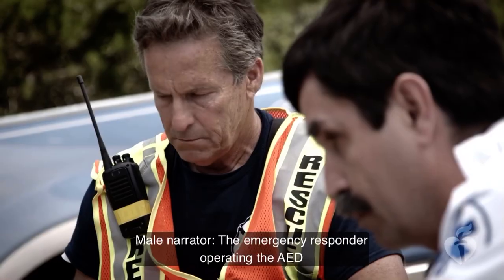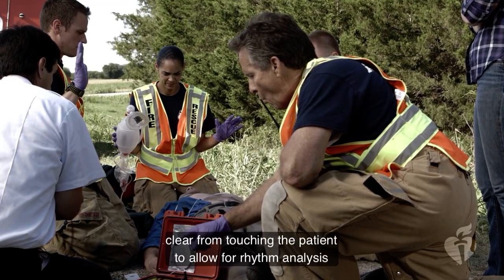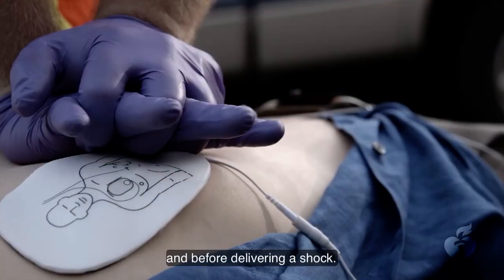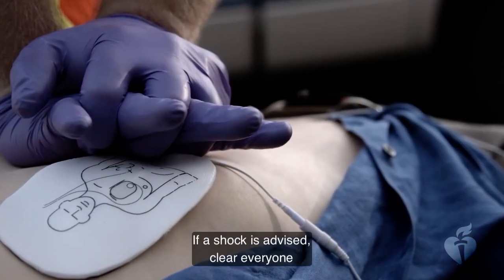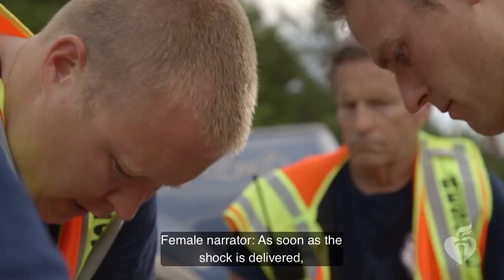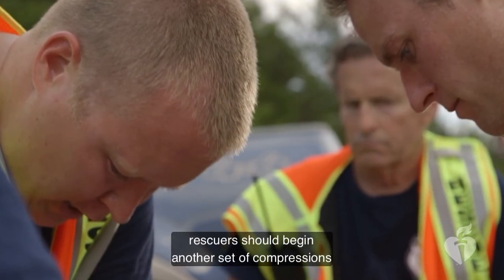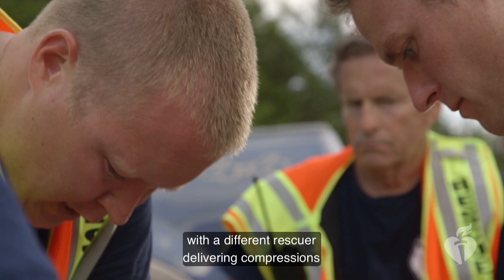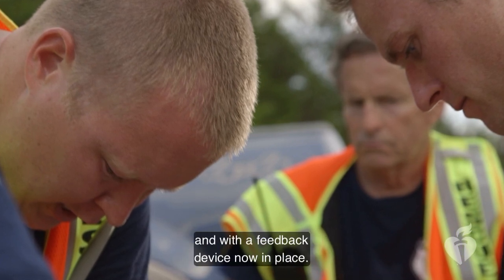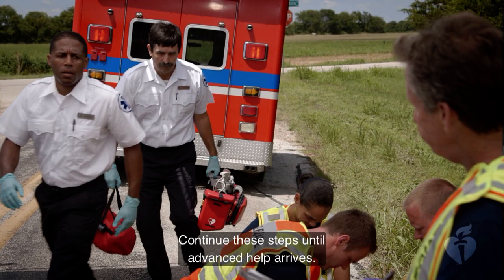The emergency responder operating the AED is responsible for ensuring that all rescuers are clear from touching the patient to allow for rhythm analysis and before delivering a shock. If a shock is advised, clear everyone and deliver the shock. As soon as a shock is delivered, rescuers should begin another set of compressions, with a different rescuer delivering compressions, and with a feedback device now in place. Continue these steps until advanced help arrives.